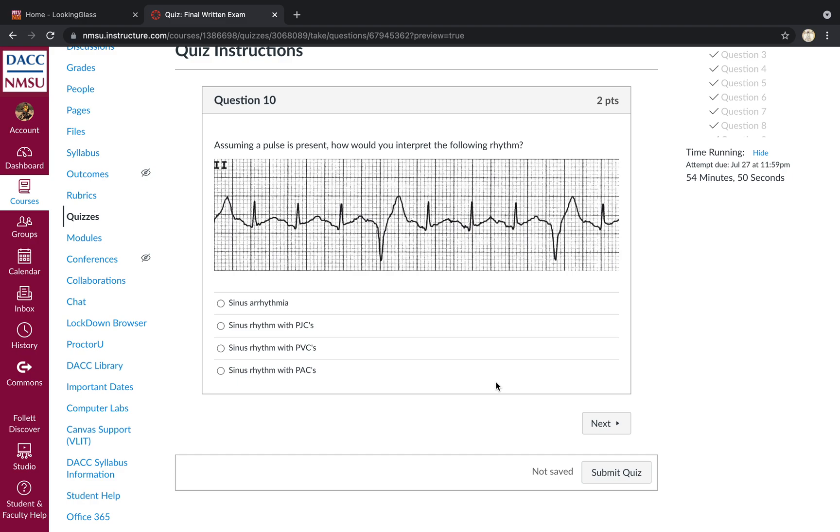Assuming a pulse is present, how would you interpret the following rhythm? So the underlying rhythm is a sinus with wide, large complexes that are bizarre looking, not necessarily associated with P waves. Those are premature ventricular complexes, PVCs.